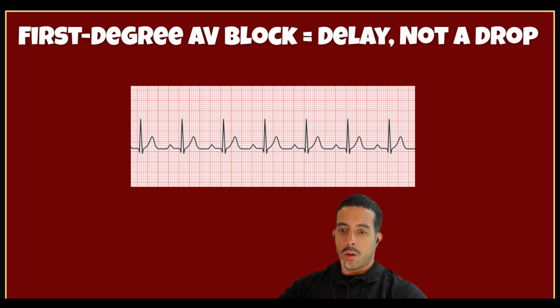So, now let's look at the P wave. It's the same process every single time. Let's look at the P wave, the QRS, and the T wave. Now, also, remember, we got to look at the large boxes. So here I see 3 large boxes, basically 4 large boxes, more or less, in between each R wave. And what sticks out to me the most is the distance between the P wave and the R wave, or the P wave and the Q wave.